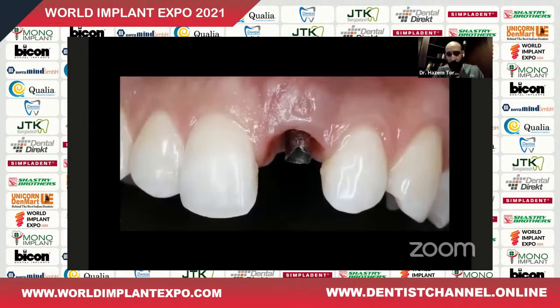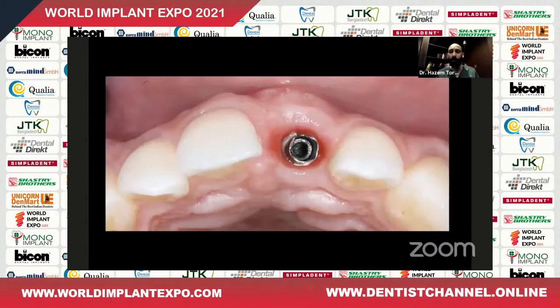And this is a situation with the old tie base. I wasn't happy at all because I needed something to prevent recession from happening in the future. I corrected the contour. Now I want to correct the problem about tissue adhesion. This will keep our tissues in a stable place. So I decided to change the material of the abutment. And this is an image where we have good contour, but we do not have optimal tissue adhesion.